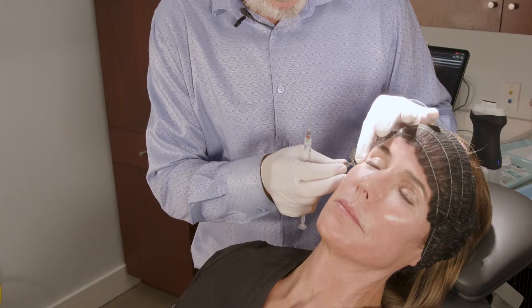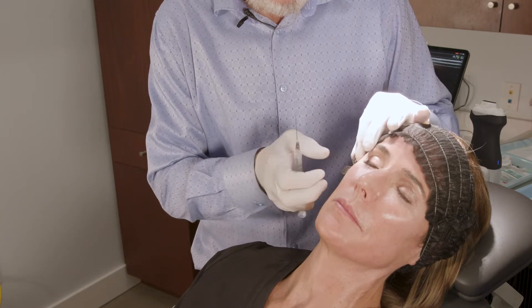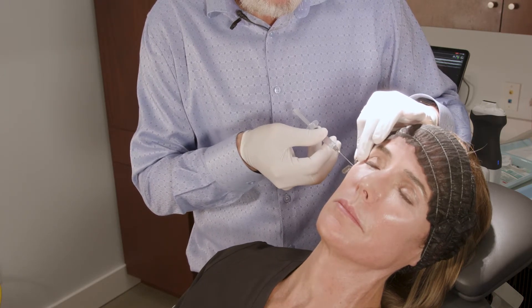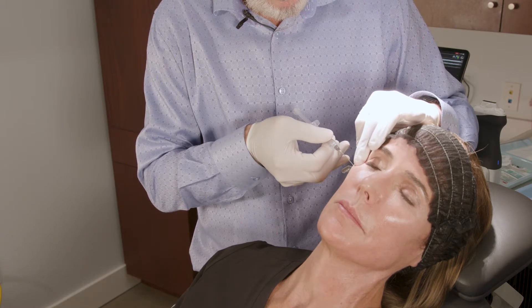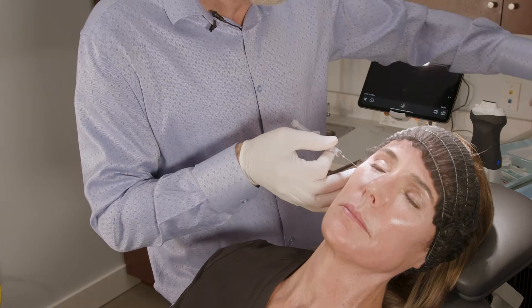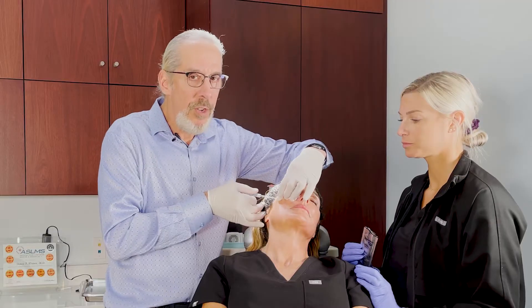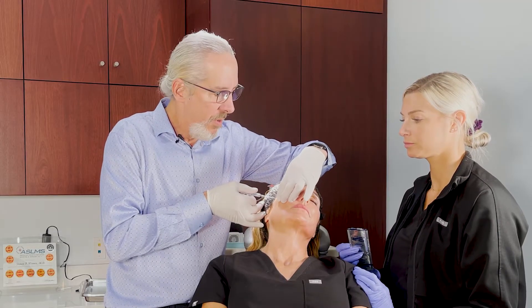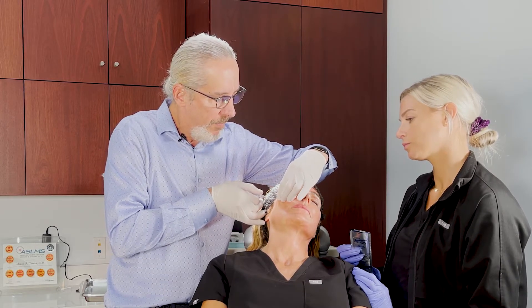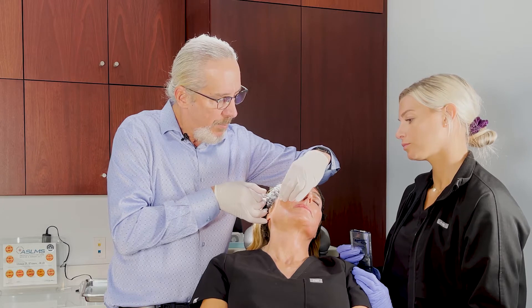I'd like to choose a point out here for my starting point. We're using the EasyGuide system, 22-gauge cannula. What I like to do is lift up to get through that SMAS — there'll be a little bit of a pop, and you've got to twist as you pop through.